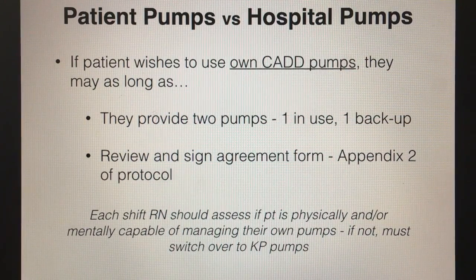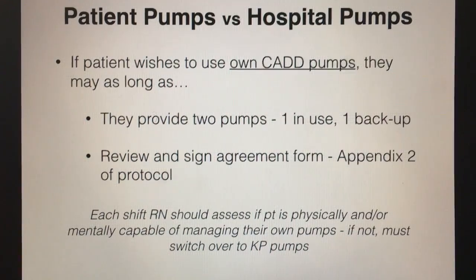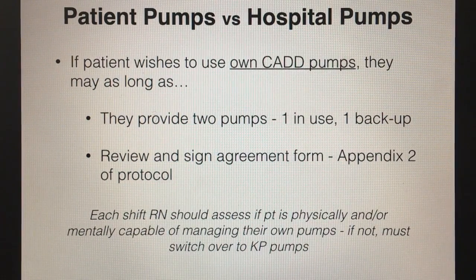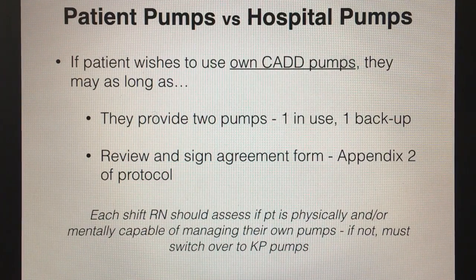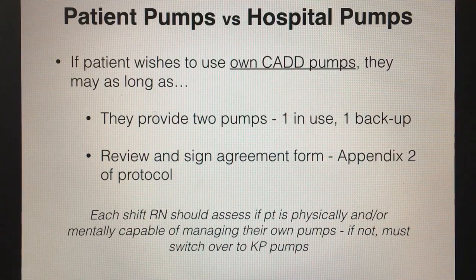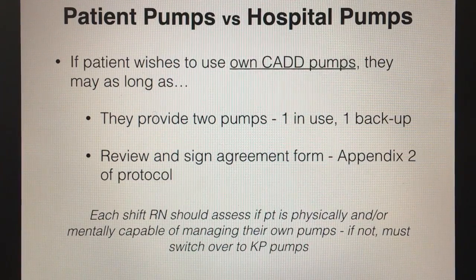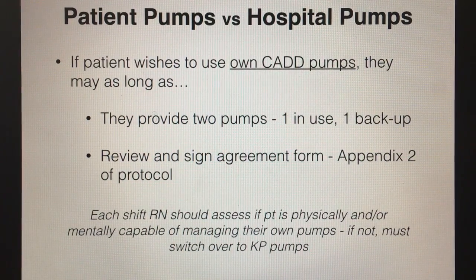Patient pumps versus hospital pumps. So if a patient comes in and wishes to use their own CADD pumps, they may, as long as they provide 2 pumps, one that would be in use and one as backup. If they only have 1 pump, they must switch over to Kaiser pumps. We can't have them on their own as well as ours. It's an all or nothing type deal.